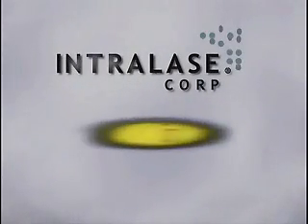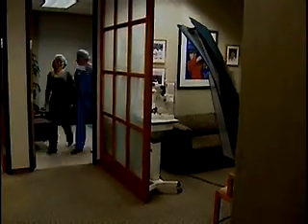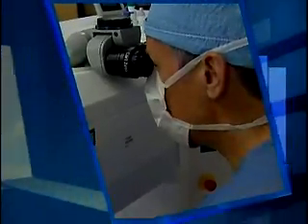Thank you. We got the left eye. Now let's do the right one. Oh, look at that. Perfect. Good job. All right. All done.